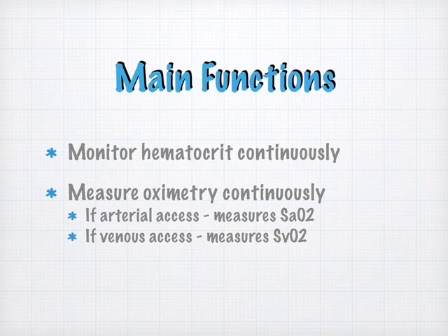Because as you know, if a person's blood pressure begins to drop, they'll compensate. They'll compensate by clamping down. Or we might compensate for their dropping blood pressure by clamping them down with norepinephrine or some other vasopressor. So if I'm removing fluid from my patient, and they're tolerating it well, my SVO2 should stay about the same.